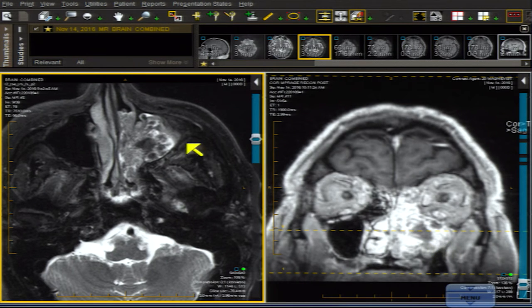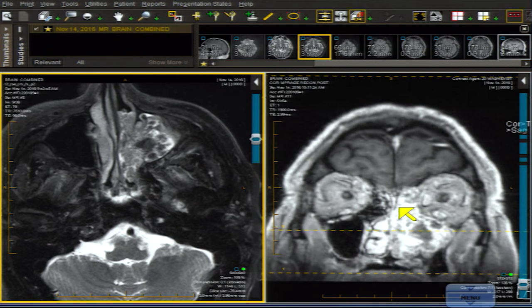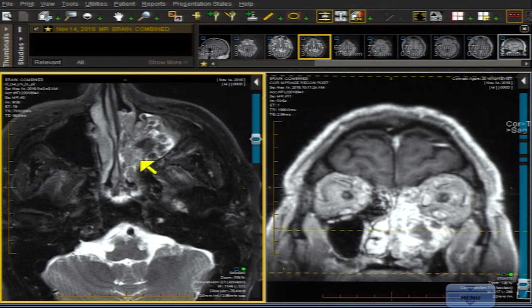A few tip-offs that you're dealing with a large inverting papilloma as opposed to squamous cell carcinoma: first, on the axial T2 it's a very convoluted-looking lesion — some describe this as a cerebriform appearance. Second, squamous cell carcinoma, unlike inverting papilloma, tends to grow into and through the lateral maxillary sinus wall and inferior orbital wall, may go into the cranial fossa, grows through the foramen ovale, and about 15 to 20 percent present with lymph nodes in the jugular digastric chain or retropharyngeal space — none of which this patient had.